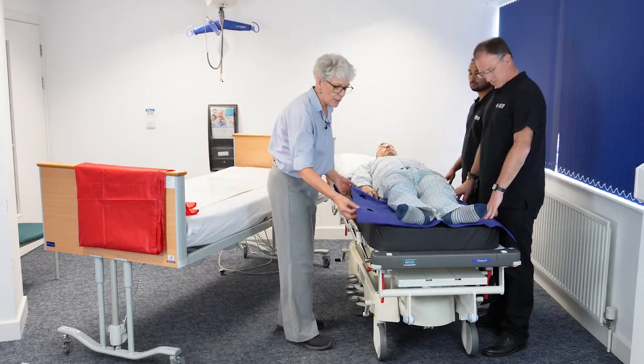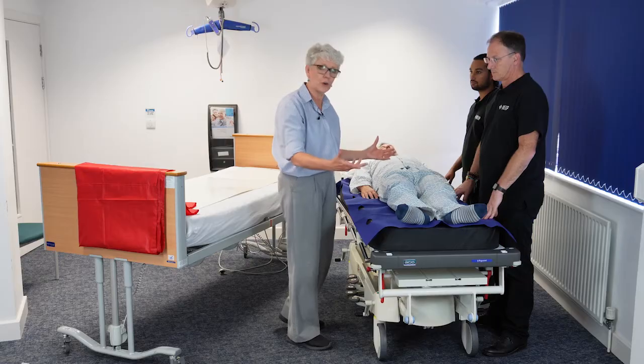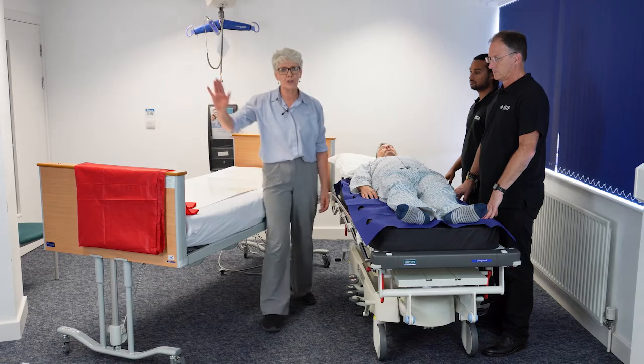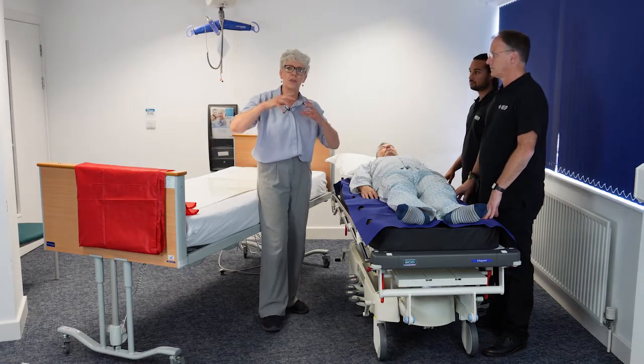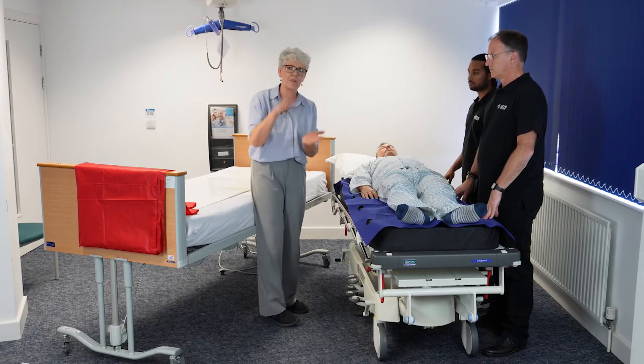We're going to use a disposable transfer sheet that's already on the trolley or the operating table. We're using a pat slide or a transfer board, and we're going to use a slide sheet. The slide sheet could be a tubular slide sheet or a flat slide sheet — entirely up to you. If you're using flats, you need two.